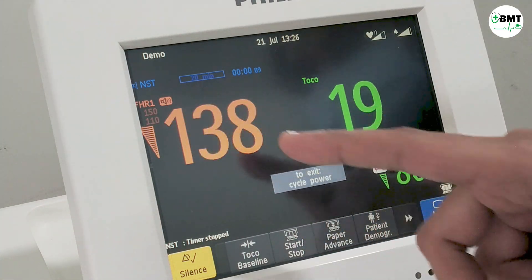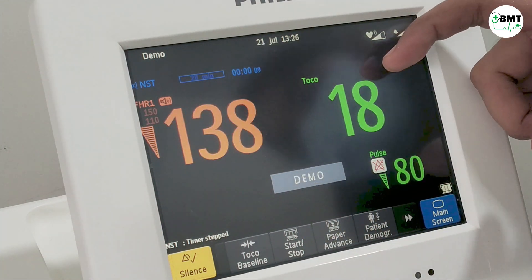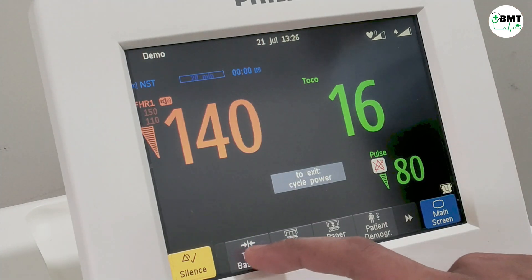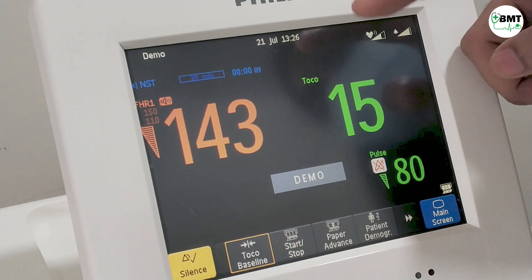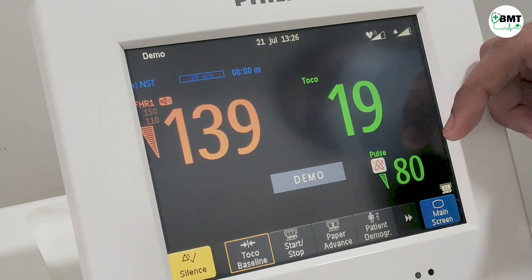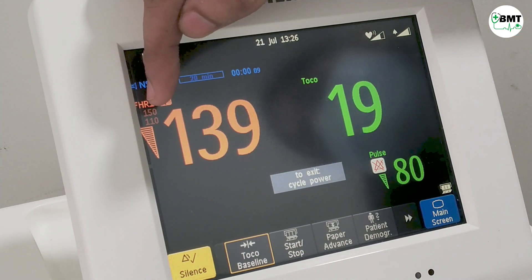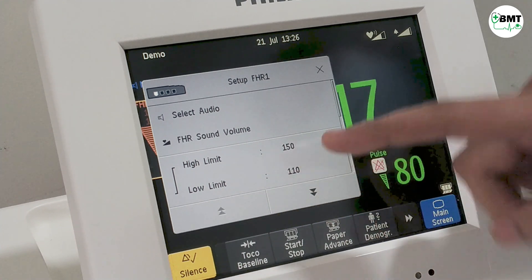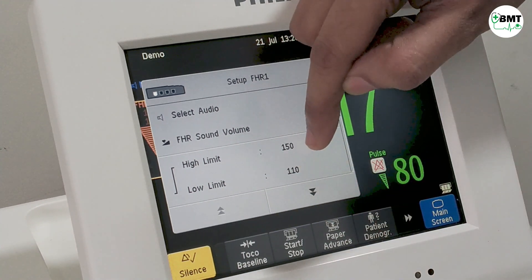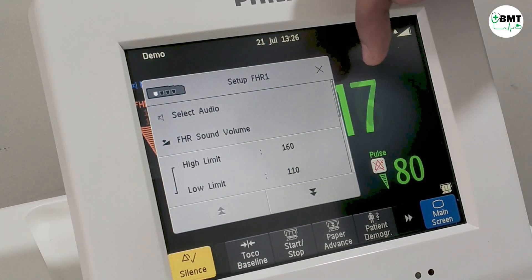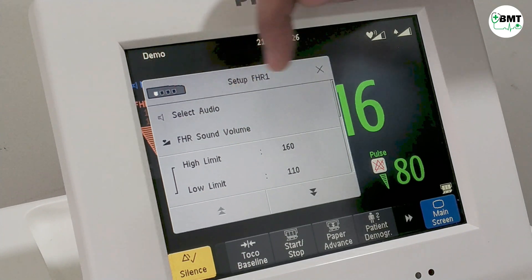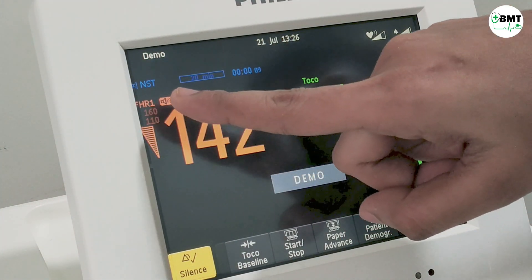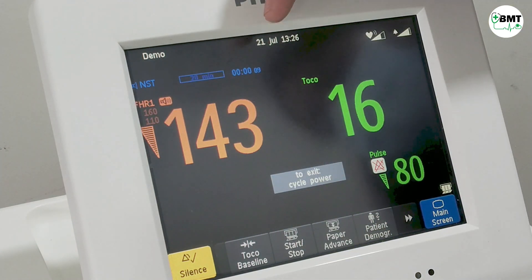This is the fetal heart rate reading and this is the toco reading. To set the toco baseline, just press on this button and the toco baseline will be set. This is the pulse reading. To set the upper and lower limit of the fetal heart rate, it can be changed from here — for example, upper limit 160 and lower limit 110. Once set, it will be automatically updated in this portion.